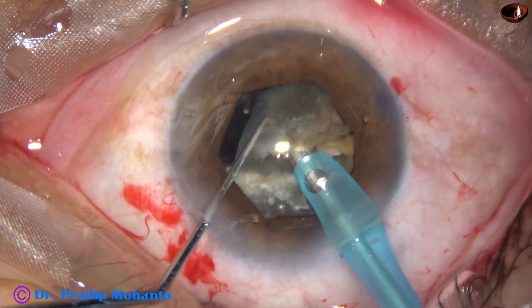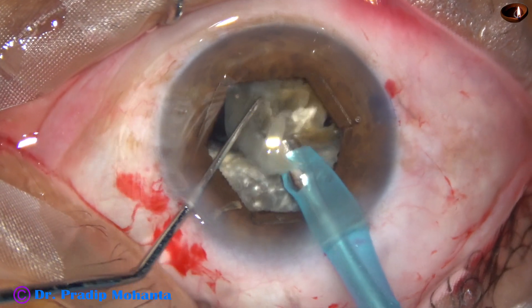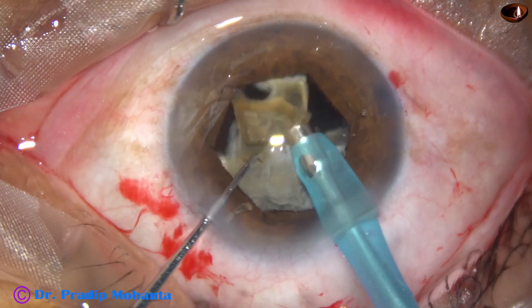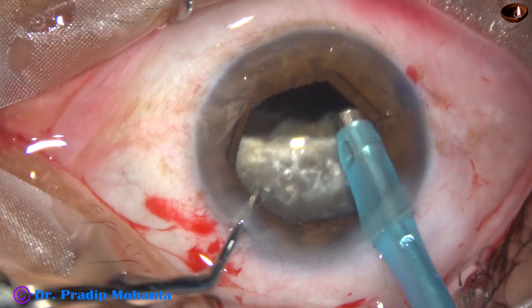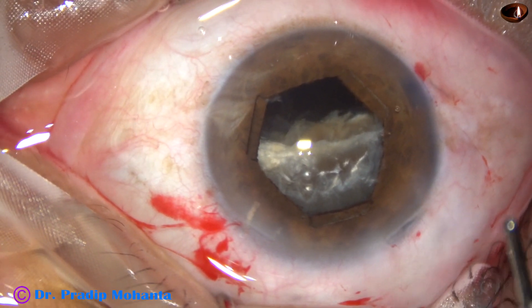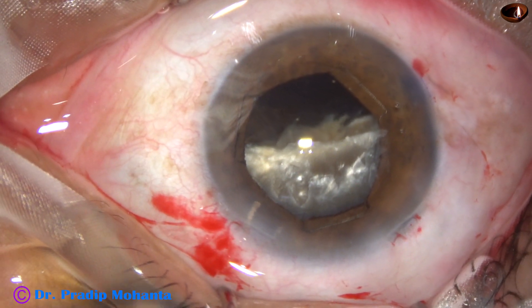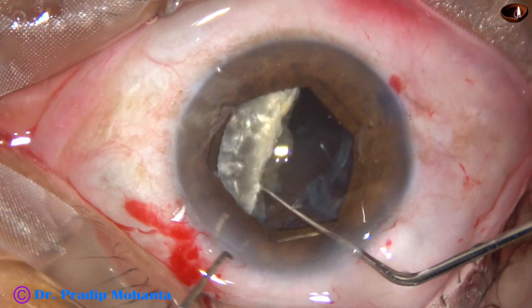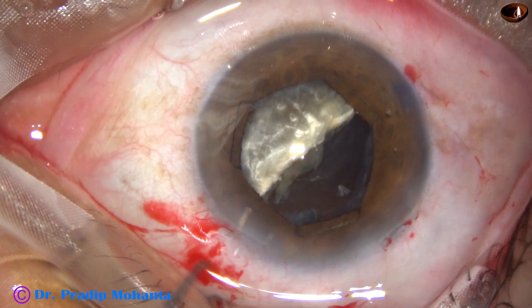Now I slowly start emulsifying this large fragment. I start emulsifying from one side, and if necessary I subdivide these large fragments into two parts; otherwise I just finish it off without dividing into smaller parts. This semi-nucleus didn't move, so I came out injecting some visco. Now using a Sinski hook to dial this fragment, this semi-nucleus, and place it so that I can approach it with the tip of the FACO handpiece.